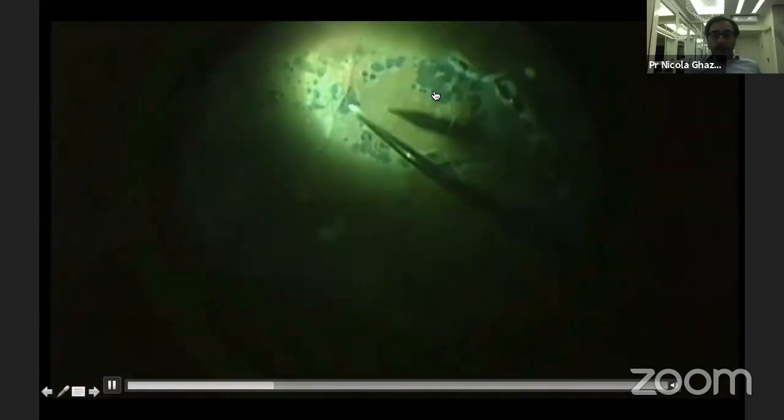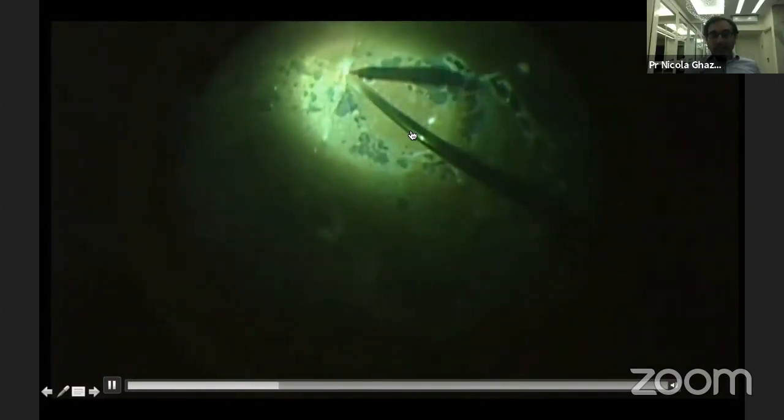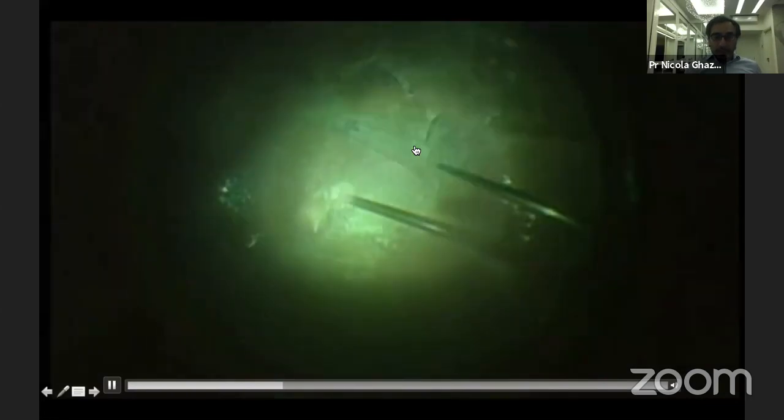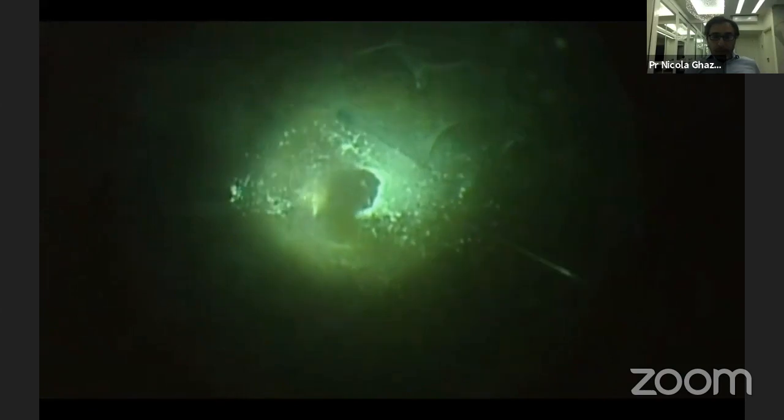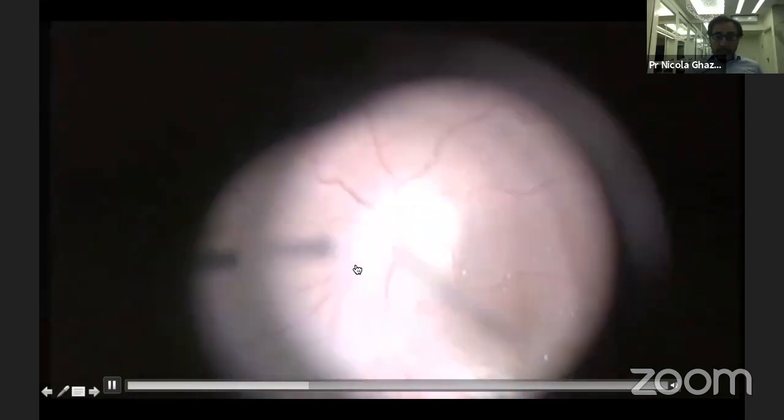So the breaks are marked, the vessels are cauterized, and then the margins of the schisis also. I like to confirm the absence of any residual hyaloid by injecting triamcinolone. And then here is the pucker being peeled gently with a Tano scraper tangentially.